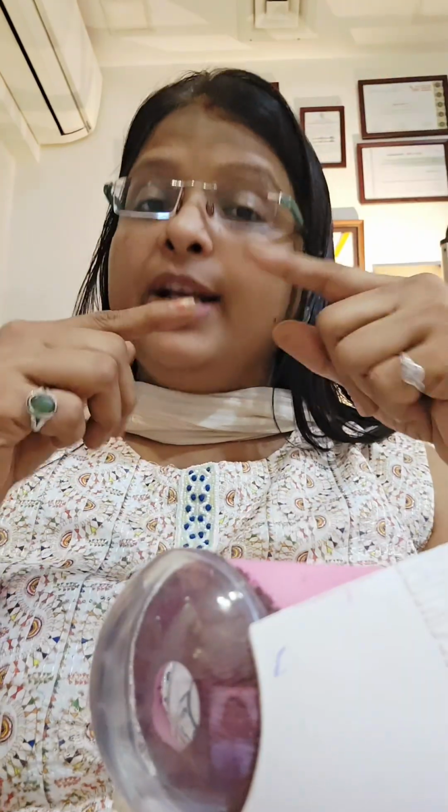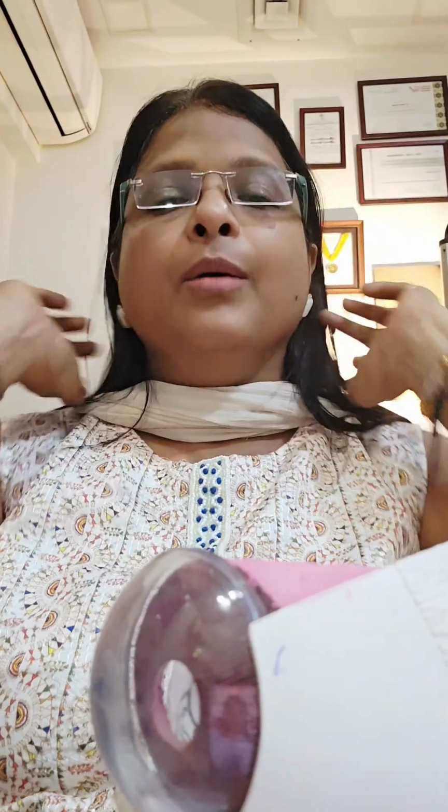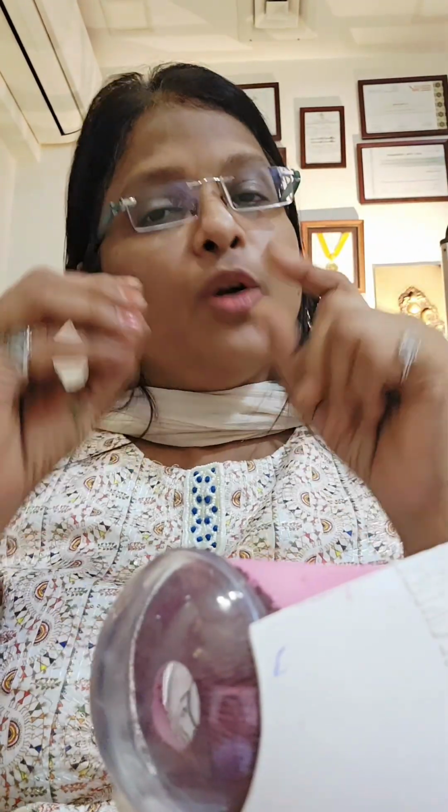But it gives you a great intermediate vision, which is the computer distance vision when you sit in front of your laptop. That distance is great with an EDOF lens. So EDOF lenses have a better application, and they have fewer optical side effects than those seen in multifocals and trifocal lenses.